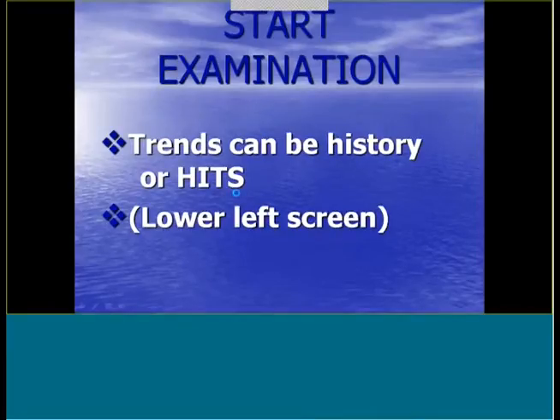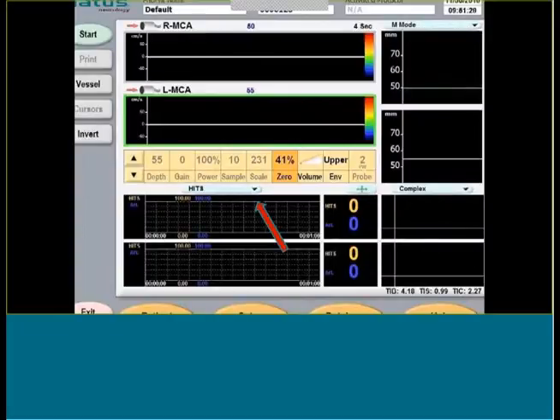And it's on the lower left-hand screen. Okay, so right here is the little drop-down bar that lets you change that. Say we don't want to do hits. We're just looking at flows.